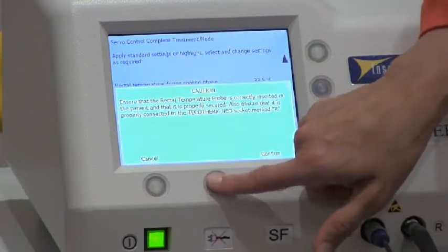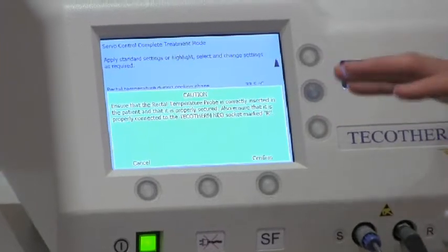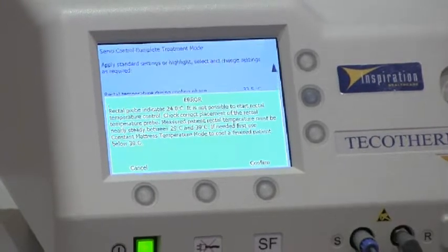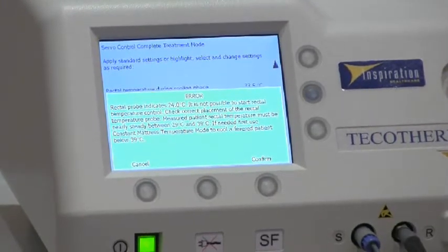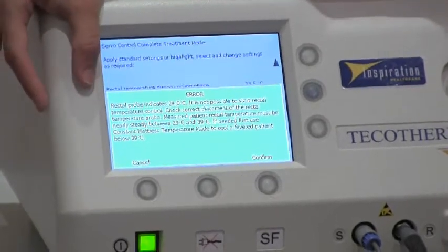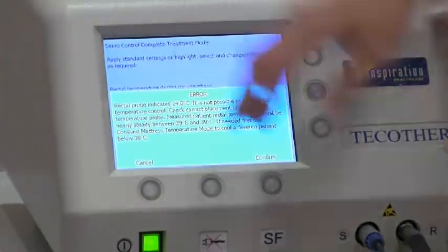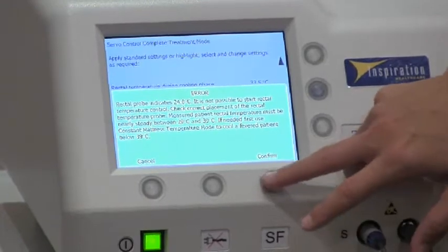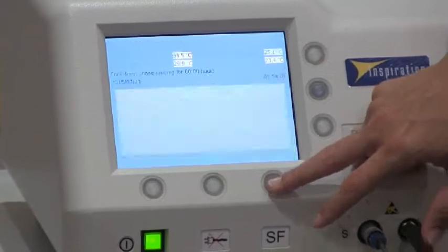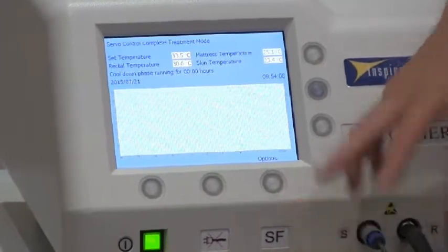Once you're happy, press Start. Again, it will ask you to confirm that the rectal probe is in place. The system will not start if the rectal probe is outside physiological range — this error message is quite important. Once the probe is back within physiological range, the system will start.